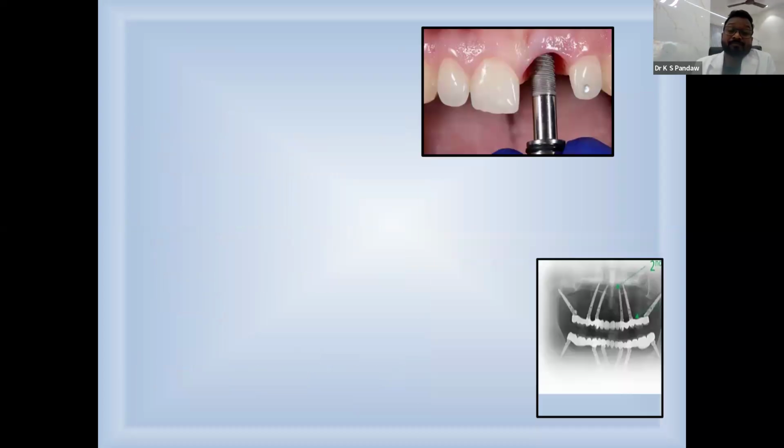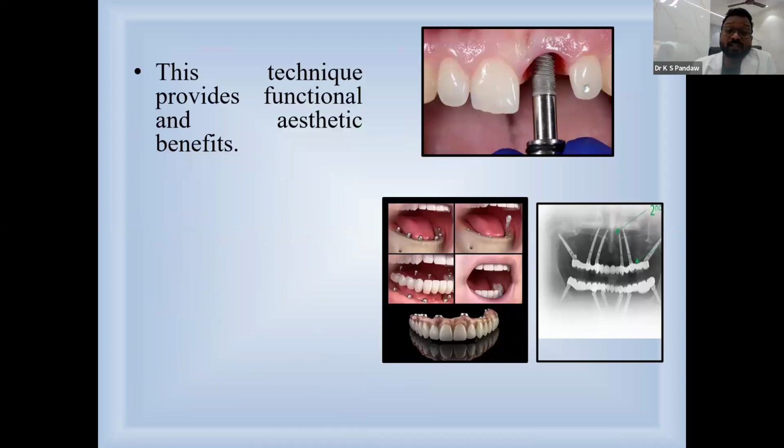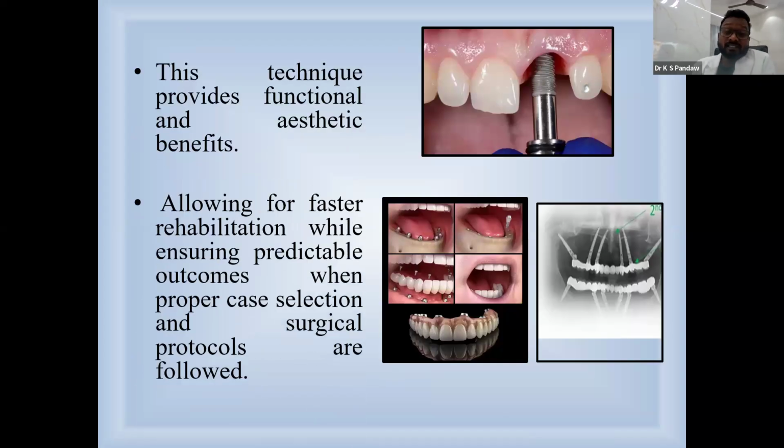And the immediate loading implant system we can use in the aesthetic zone, because no one wants to live without teeth for even a single day. Everyone wants a quick replacement.